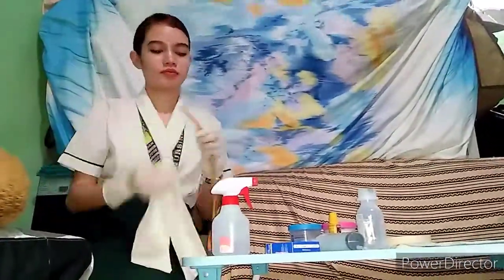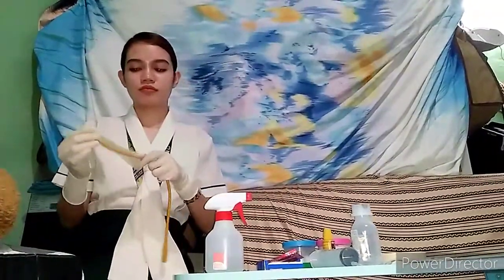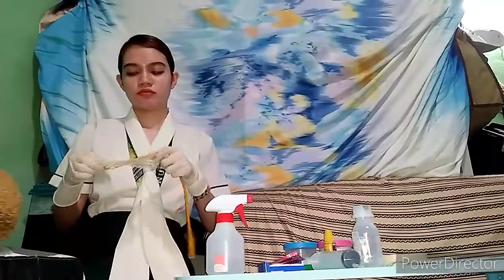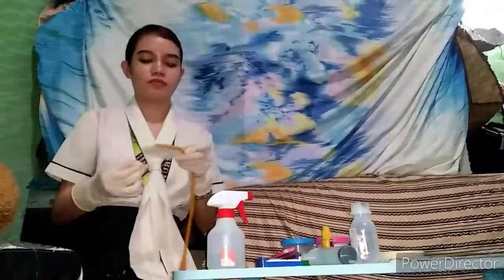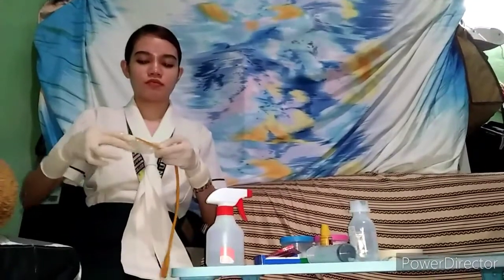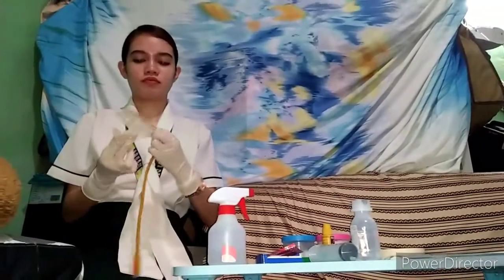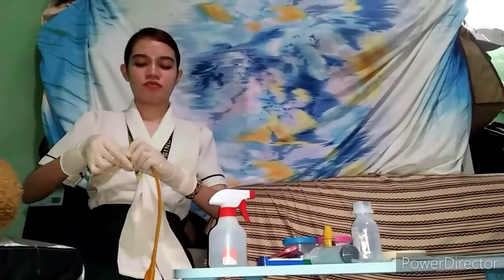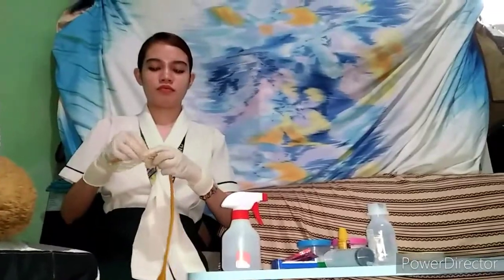Prepare and assemble the UBT kit. Insert the Foley catheter halfway of the condom balloon, leaving a small portion of the balloon beyond the tip of the catheter. Carefully wrap one rubber ring around the base of the balloon, tying it exactly tight: not loose, but not too tight that it will prevent the inflow of water.